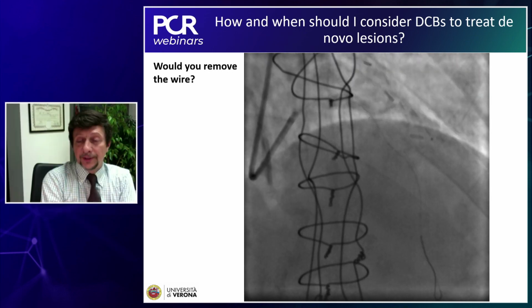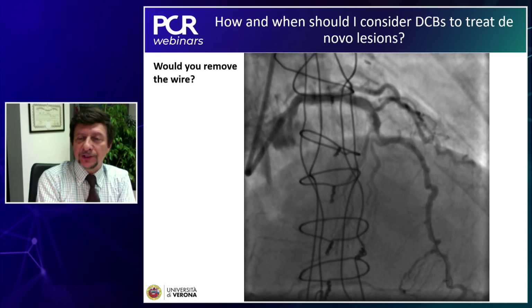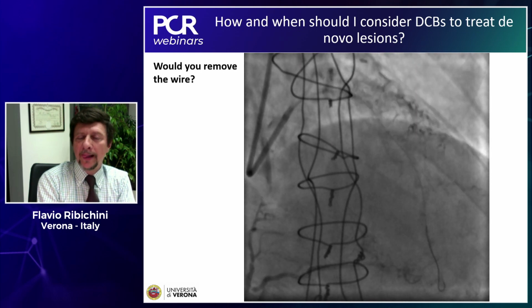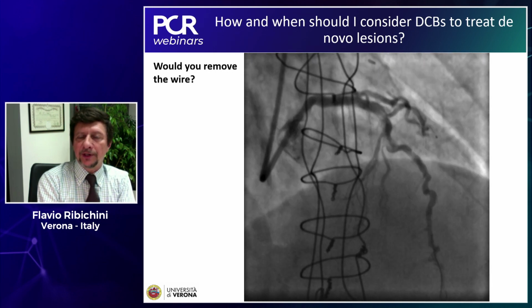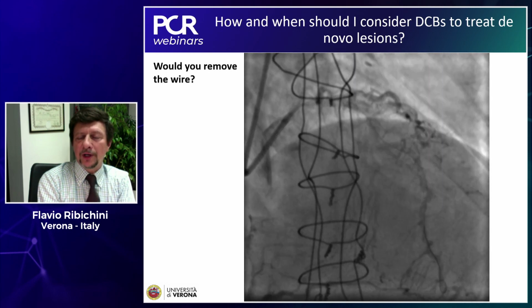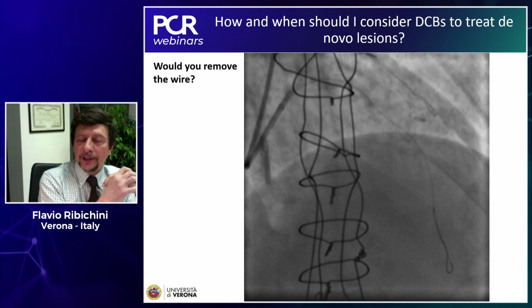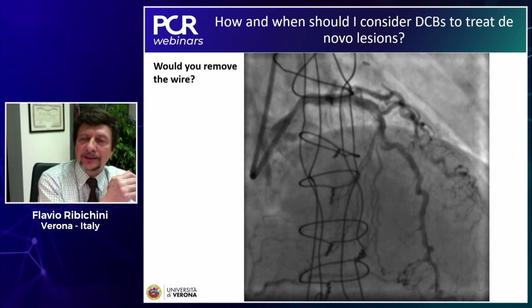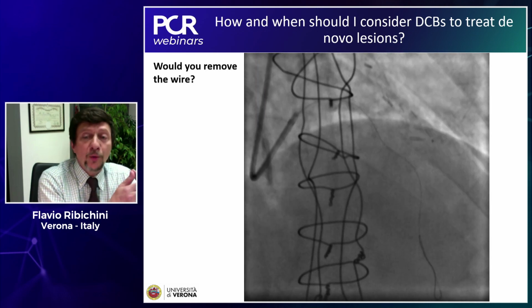Well, this is a really difficult decision. How is the patient feeling? No chest pain, normal ECG, good blood pressure, there is good flow. If you have a look at this with, for instance, intravascular imaging, you will get very scared and you will never leave this dissection without a stent. If you are used to leaving these dissections, as Fernando has shown, the occurrence of acute MI after DCB is significantly lower than after stent. So either we trust that data or we don't.